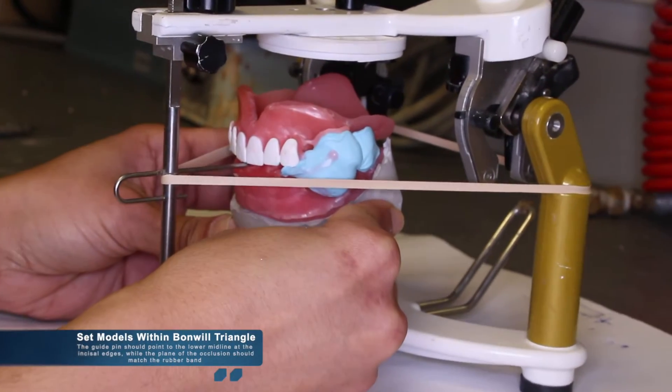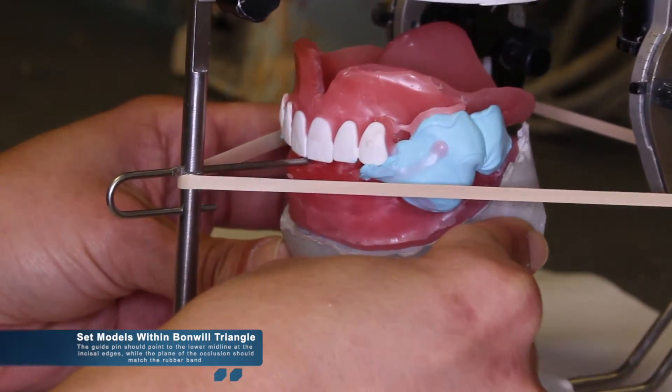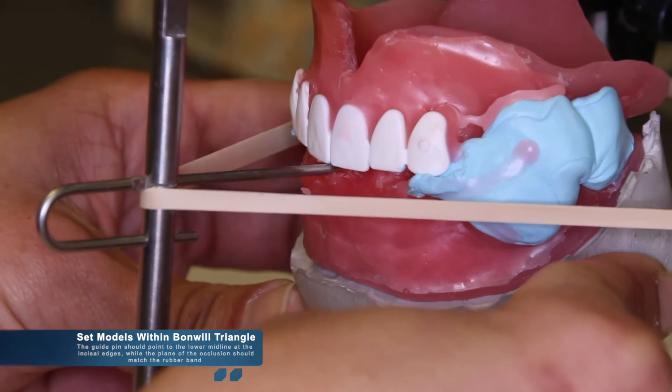Before mixing plaster, you should do a trial run and place the models exactly where they should be within the Bonwill triangle.